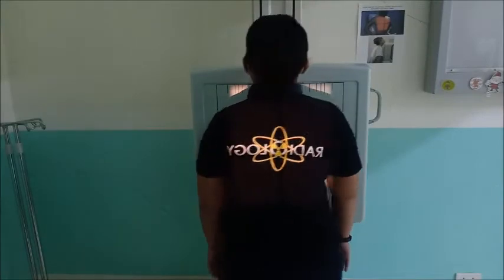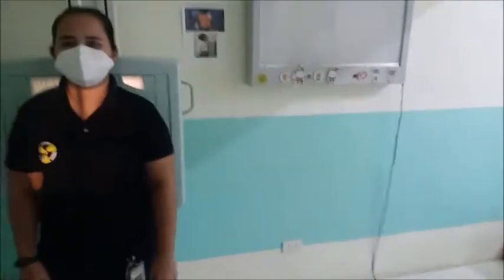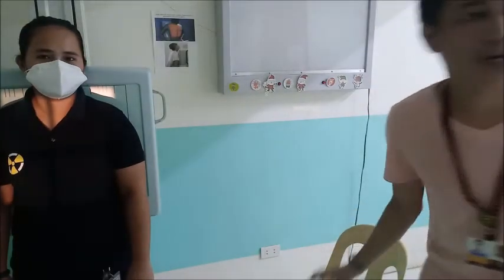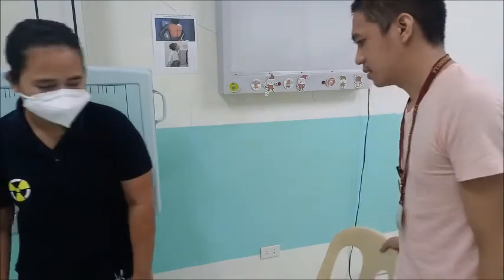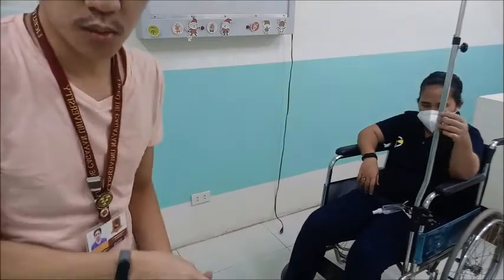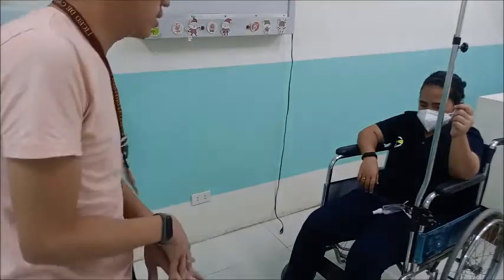Okay? So, relax mo. So sometimes put sa na sa inyong mga discussions, also questions usahay sa exam, just PA an examination, just PA ang request, but then the patient is not able to stand. So naka-wheelchair lang si patient. Okay, so we have a patient who is in a wheelchair.